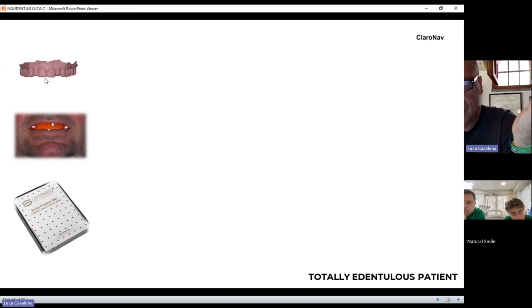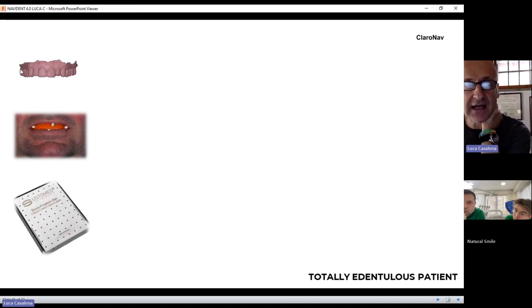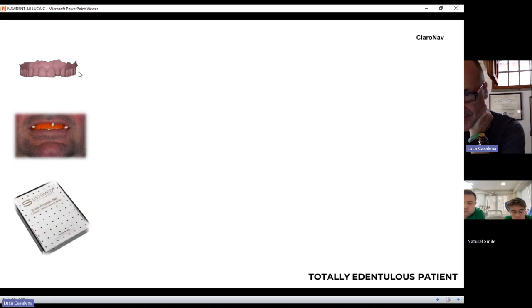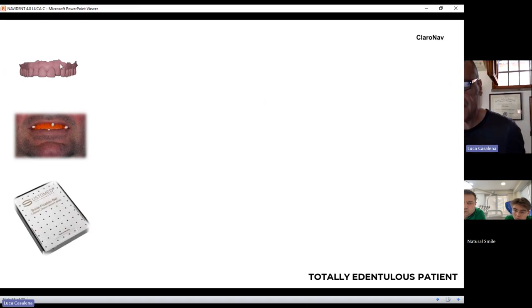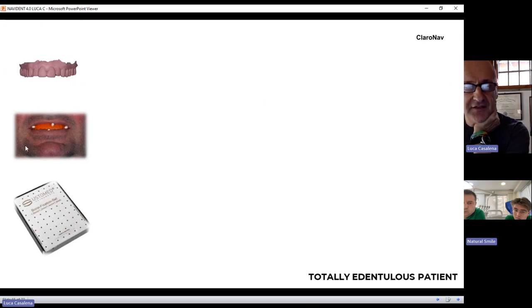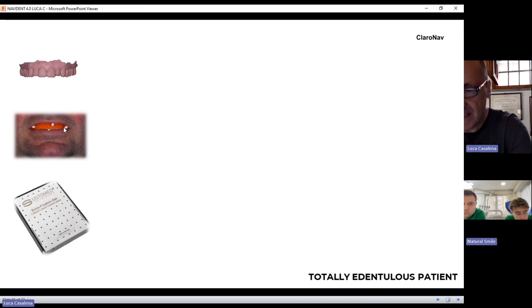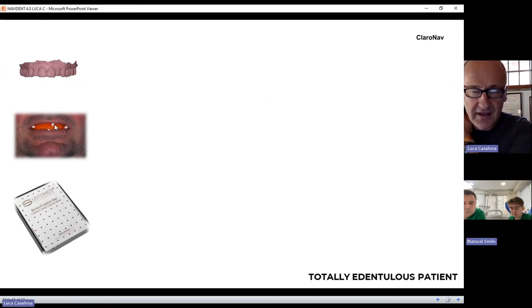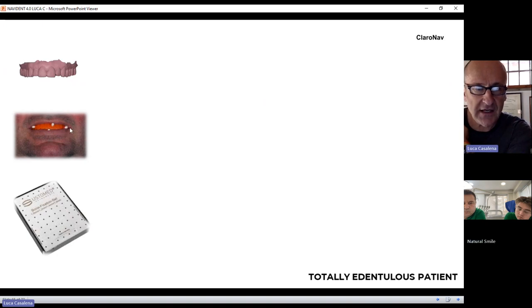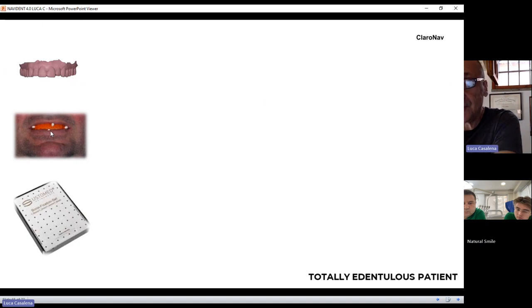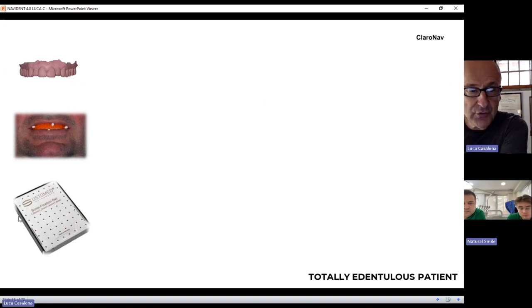You don't yet know the patient's bone, but you start by looking at the ideal prosthesis for the specific patient. Then you need to replicate the wax-up as a mock-up — a radiologic prosthesis. This mock-up has dots on it that are radio-opaque and extruding out of the mock-up, not flat. When they are CBCT scanned, they will be visible on the CBCT.